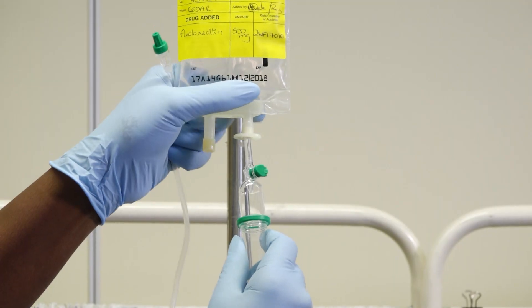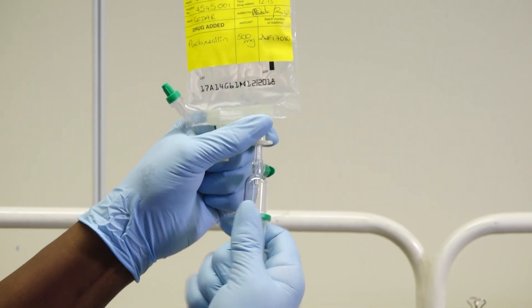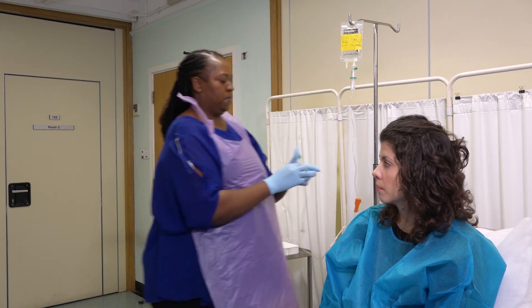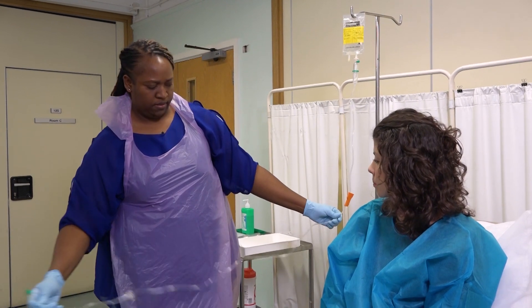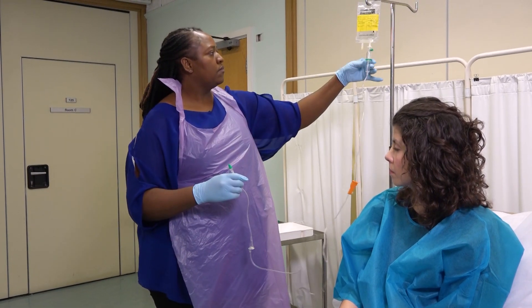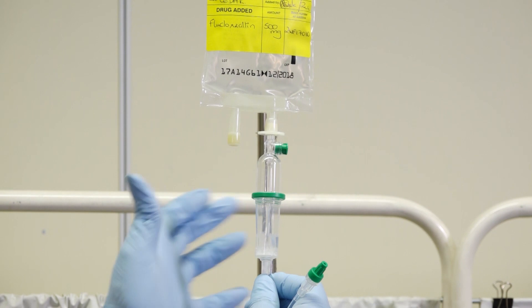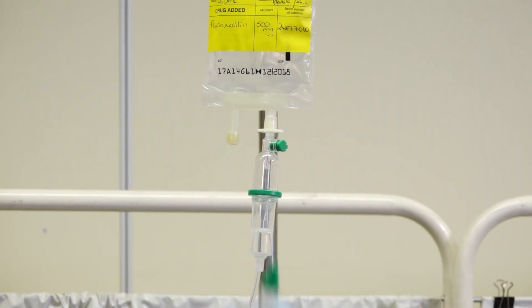Push the spike firmly into the port with a twisting motion, ensuring the opposite end of the tube remains safely in your hand. Squeeze the drip chamber several times until it fills halfway with fluid.